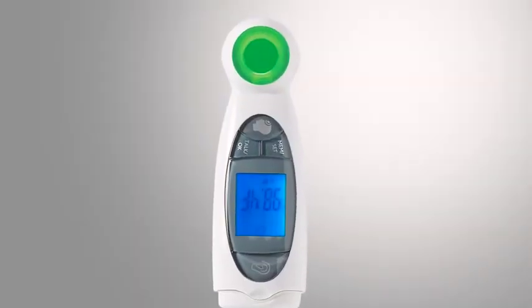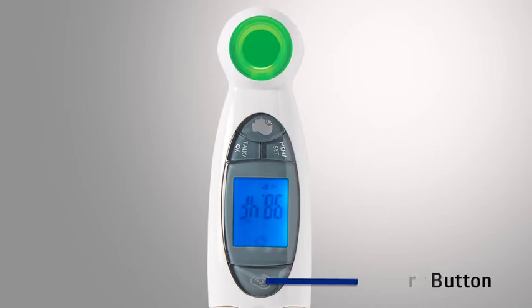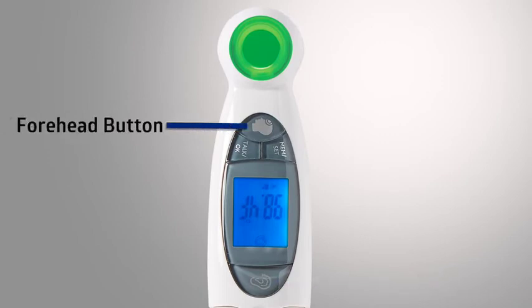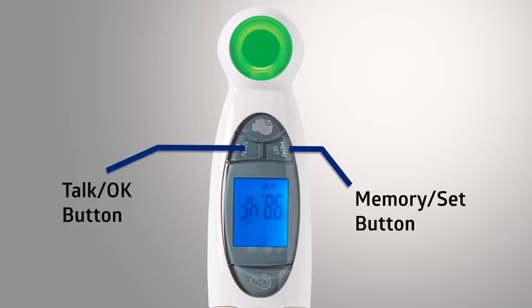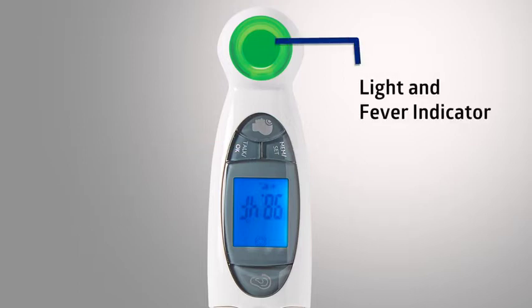Let's take a look at an overview of the unit. The ear button is used for taking ear temperature measurements. The forehead button is used for taking forehead temperature measurements. There is also the memory, set, and talk OK buttons, as well as the light and fever indicator.